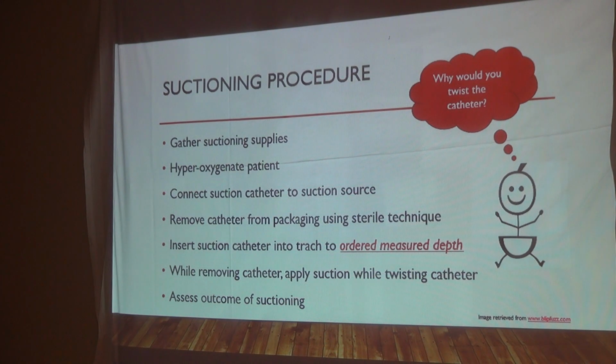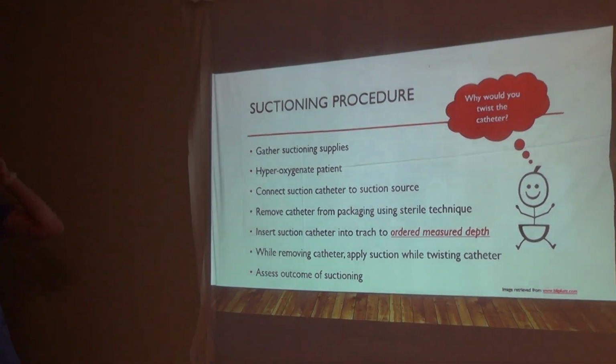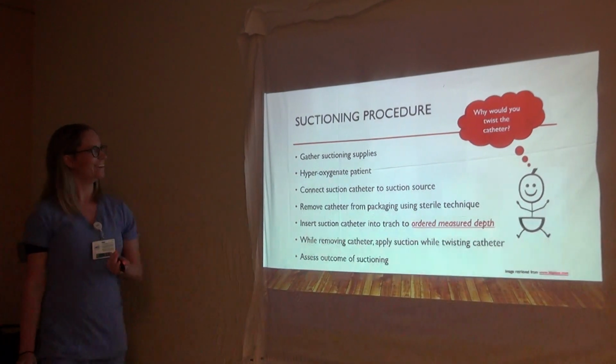If you're suctioning a patient a lot, you do want to give them a break between passes to let them recover, because you're essentially taking their breath away as you suction. So give them like a minute to have some deep breaths. You can bag them. After you suction about 3 times, you do want to give them a decent break, a couple more minutes than just 1, unless it's an emergency, in which case you can keep on suctioning. And then I have a video about suctioning.